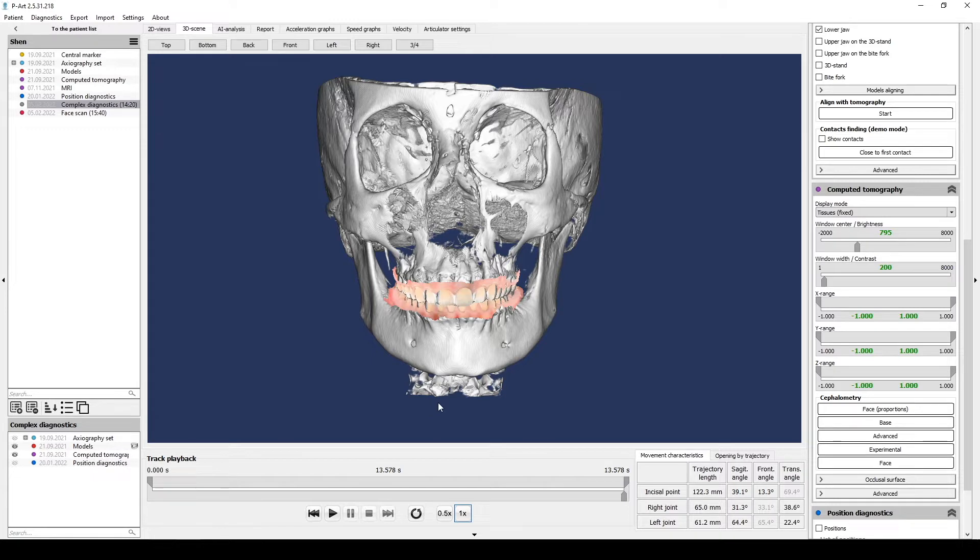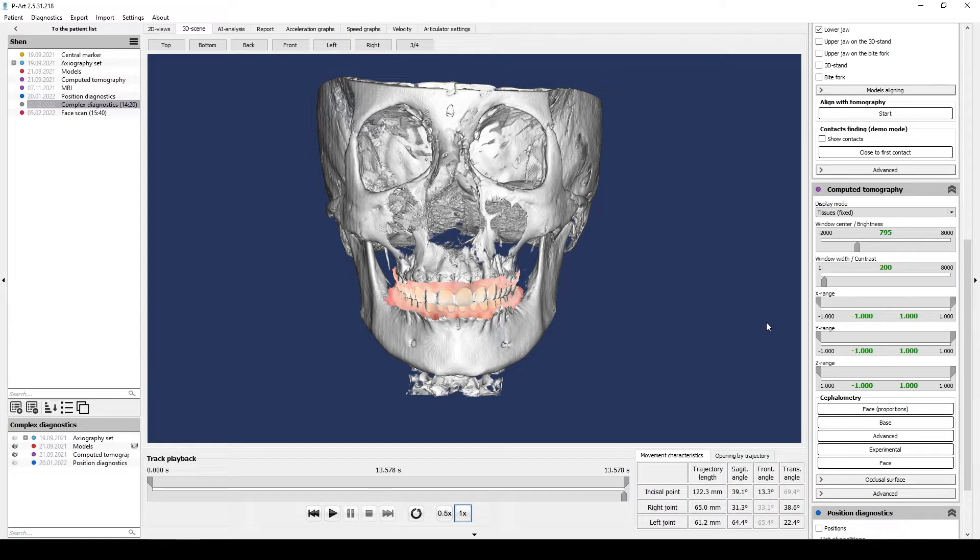The position of occlusion plane relatively Frankfurt, HIP and Spee planes. Occlusion plane built on dentition of the lower jaw.